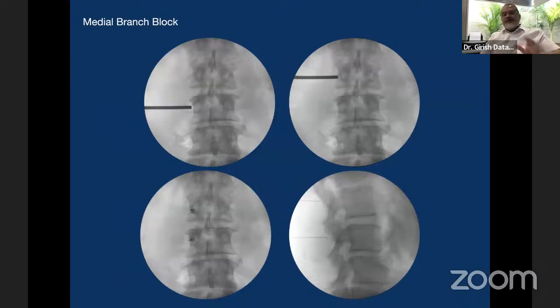So here in this particular patient, we always start with what is called a medial branch block, because essentially what I see as the advantage of a transforaminal endoscopy is doing it under local anesthesia, because the foramen is again a very favorite site for pathological or congenital anomalous anatomy. So you may have a conjoint root, you may have a lot of things. So I don't prefer any of my cases transforaminally to be done under general anesthesia or regional anesthesia.